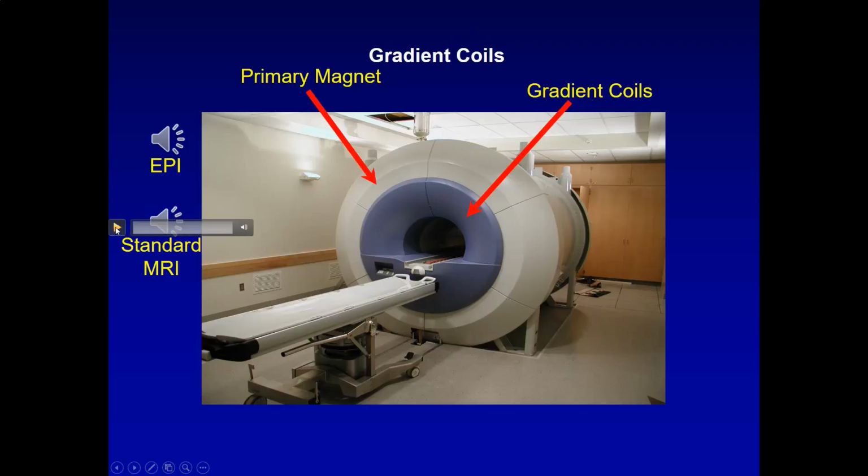Here is a standard MRI sequence. And now, echoplanar imaging is used for functional MRI. That requires much, much faster switching of the gradients. So these forces occur at a higher rate. They're happening more frequently. When there's a higher frequency of something, the pitch is higher, and the gradient strengths are often higher, so we get a louder noise. That's why we give subjects earplugs.